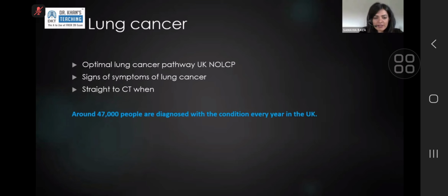The volumetric software creates a 3D volume of the lesion. It creates a ball shape, or it follows the irregular shape of the nodule in the 3 planes, and it gives you an accurate assessment of the nodule. A mathematical calculation can't do that. So if there is no volumetric software, you're absolutely allowed by the BTS guidelines to follow your 2D dimensions.